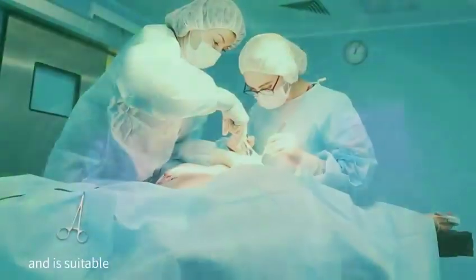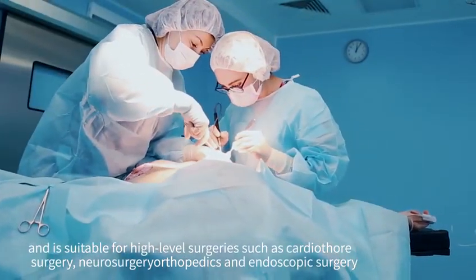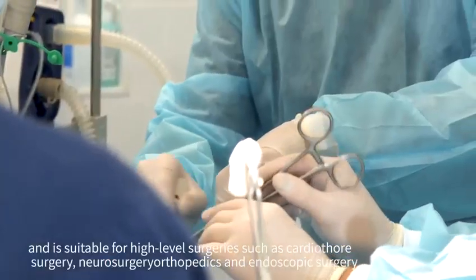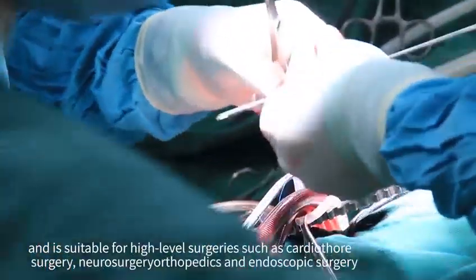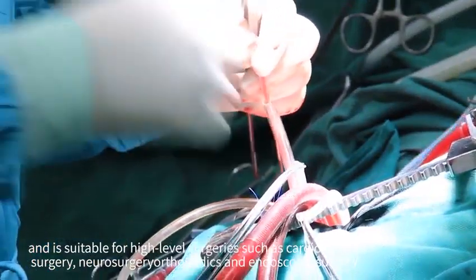It is suitable for high-level operating rooms such as cardiothoracic surgery, neurosurgery, orthopedics, and endoscopic surgery.